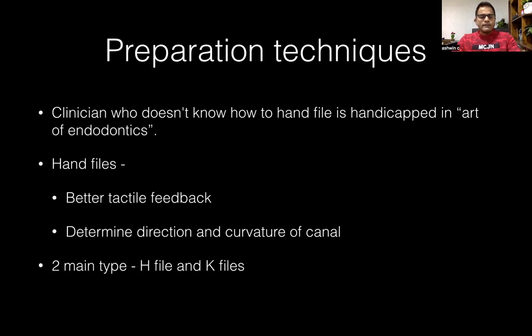Okay, so let us see what are the advantages of hand files. They will give you better tactile sensation. What do you mean by tactile sensation? It means the feel of the canal. Entering the canal means you are actually entering another person's house where you do not know what is kept where. And if so, at night you will stumble. For that, you have to take the feel with your hand. Where is the switchboard? That feel is called tactile sensation.